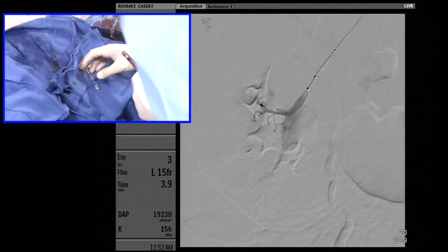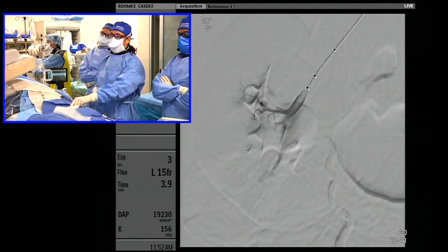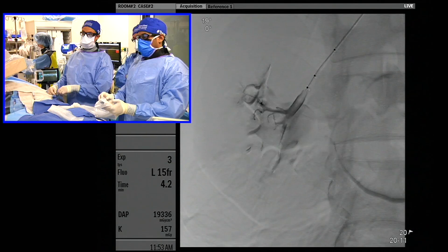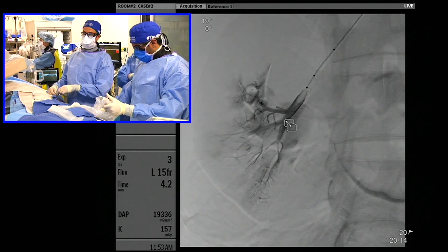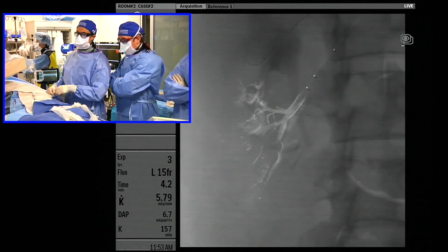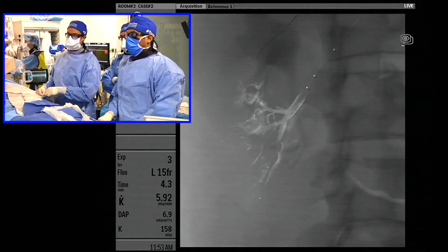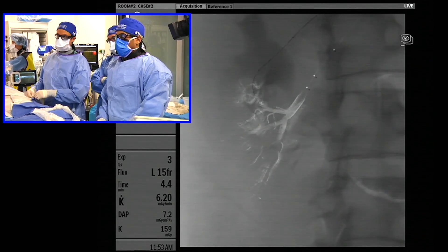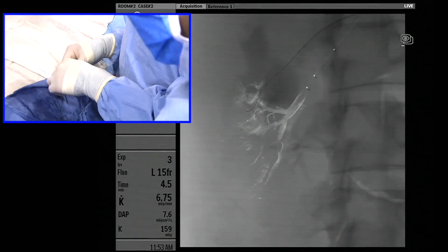Interesting — now we're not seeing that side branch. We were just commenting that we don't see the one off to the side. Let's get the wire and see if we can get in a little bit further, then put the balloon up maybe distal to that other branch. This is a small branch coming off — I don't know that it's even big enough to accept a microcatheter. I think the balloon may help direct the flow into the AML, but we'll see.